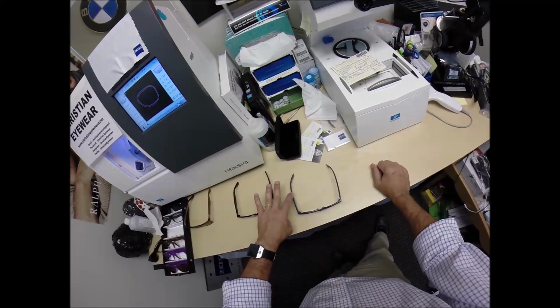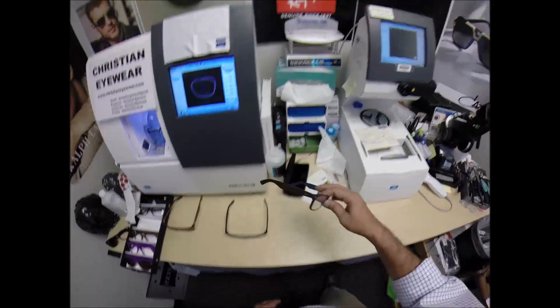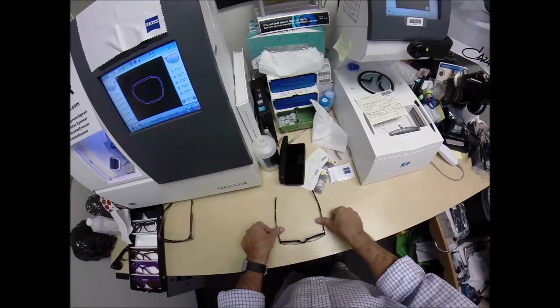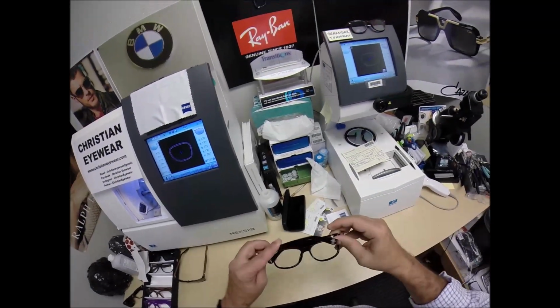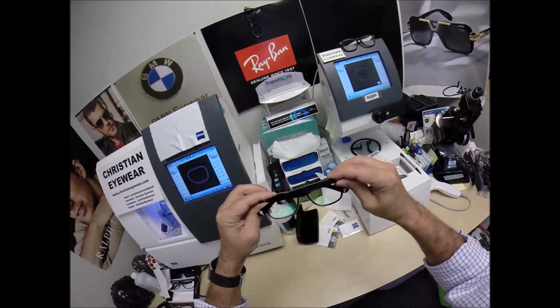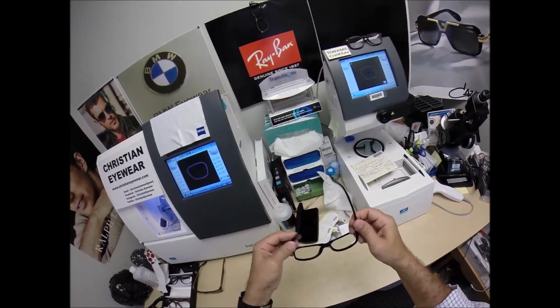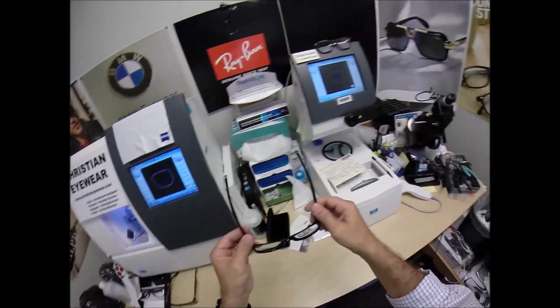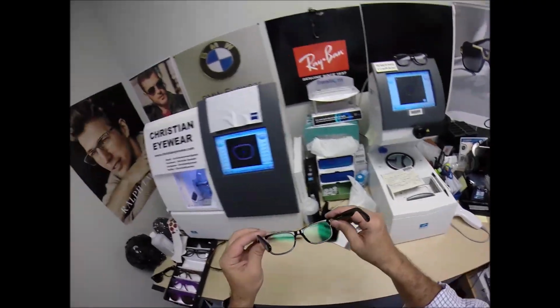So when I press down on the counter, on the frame, they'll wobble on the counter, but they sit level on me. So I'm going to flip these over, press down, there is no wobble. Close each temple to make sure they overlap perfectly, and they do. That neither temple is askew. Check the tension on each hinge. Make sure that's uniform. If one was tighter, one was looser, I would tighten the looser one, I would loosen the tighter one until they were matching.